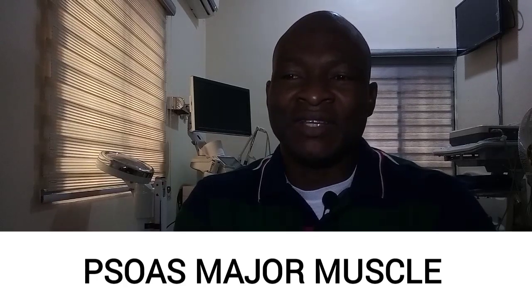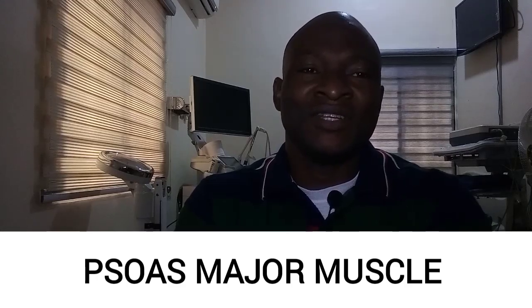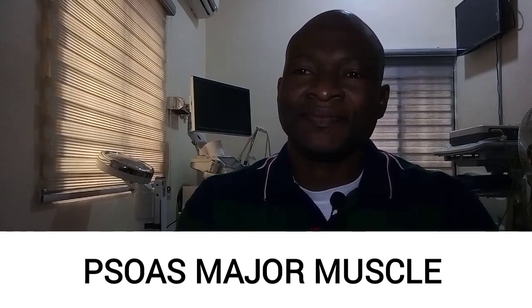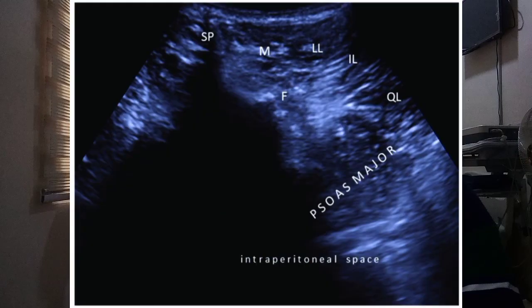The medial border of the kidney rests against the lateral border of the psoas muscle. And this is an image to show the psoas muscle and other associated muscles. And on ultrasound, this shows the psoas major muscle as it relates with other muscles, quadratus lumborum, intraperitoneal spaces, and so on.